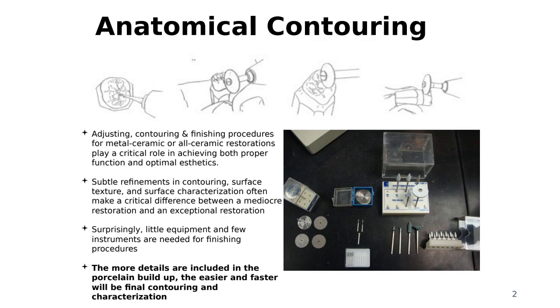All right, so today we're gonna talk, continuing our instructions with applying porcelain, and also what makes a case successful, right?